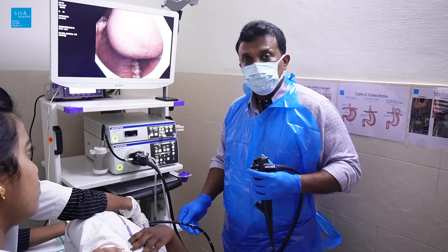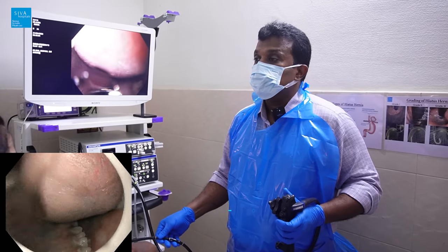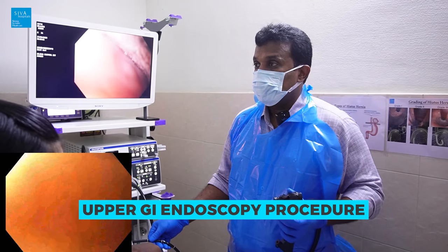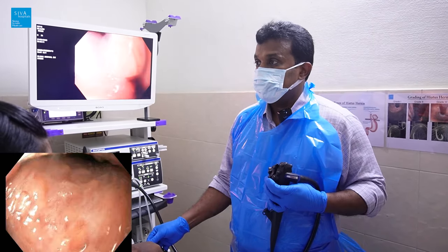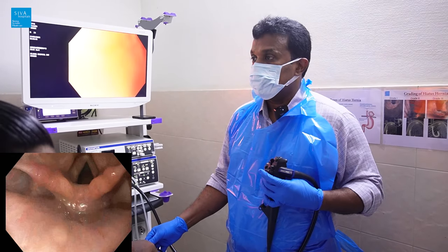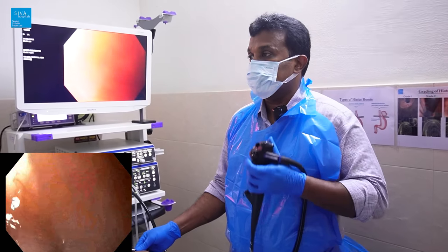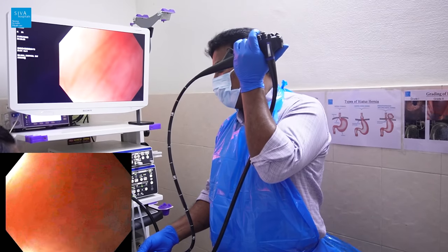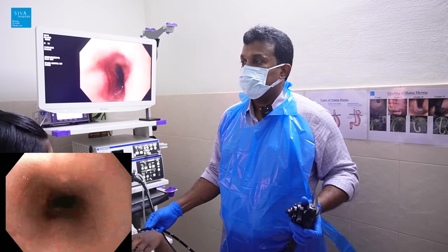The patient has had discomfort for two years, so we advised endoscopy. Endoscopy involves introducing the scope into the mouth, visualizing the uvula, epiglottis, and vocal cords. Going behind the vocal cords, we enter the esophagus — this is the upper esophagus.